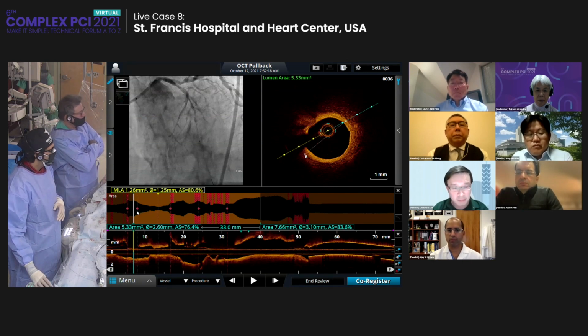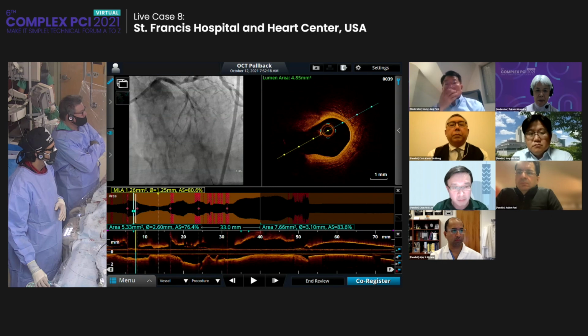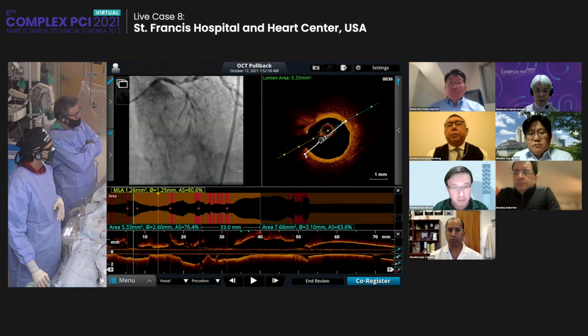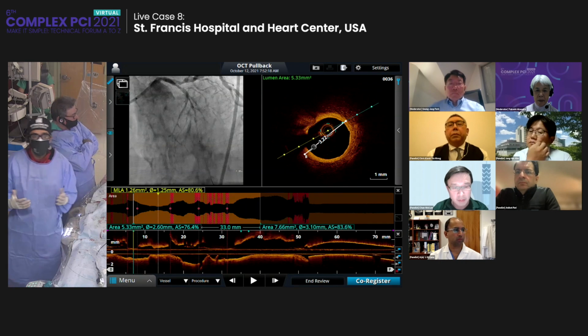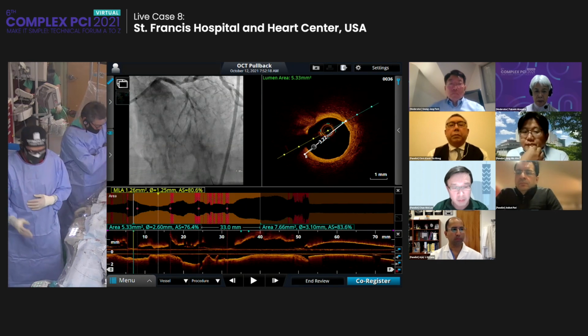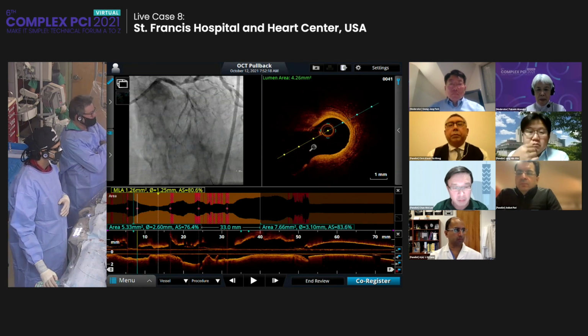And so what we did is find a landing zone just distal to that tight stenosis. Now, the way we do this is by scrolling for the most normal segment. And we'll actually notice that this here is our more normal segment. And we made our first measurement, which is 3.22. When we use EEL guided criteria, we round down to the closest stent size. We know we need a 3.0 stent and a 3.0 NC balloon for post-dilation.